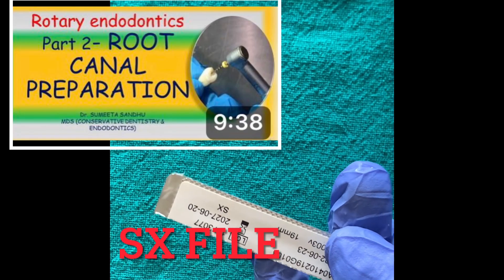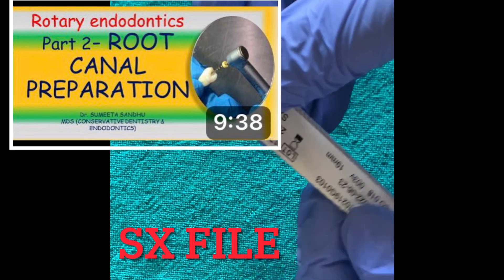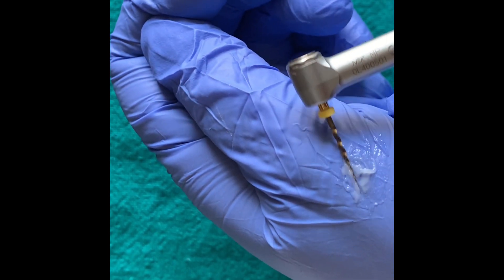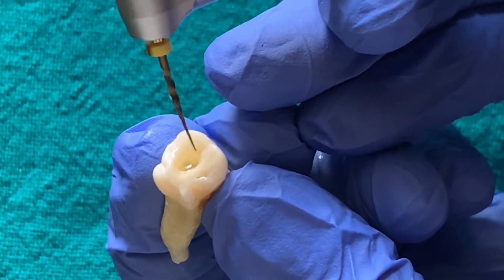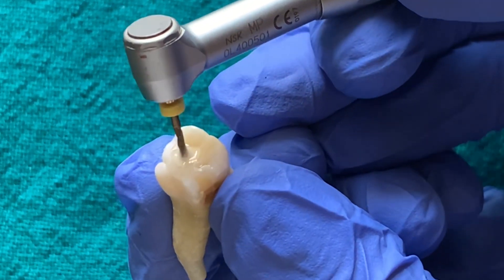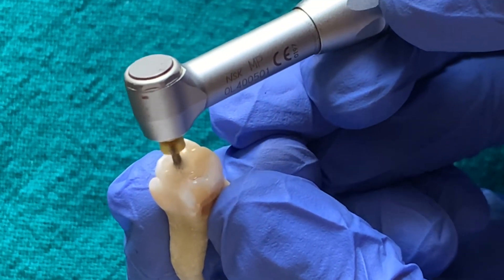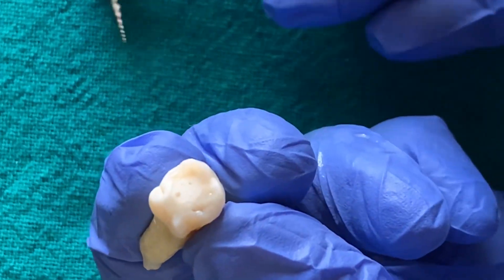I have discussed in detail how to use these files in the above-mentioned video — do check it out. I am starting the preparation with the SX or ShaperX file. This file is shorter than the other ProTaper Gold files. We coat it with a lubricant and insert it in the canal. It is used in a brushing motion, intentionally brushing to the outer wall. This moves the canal slightly away from the furcation and gives a better coronal shape to the canal.